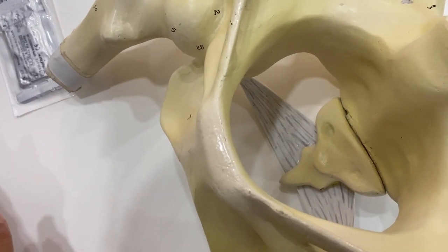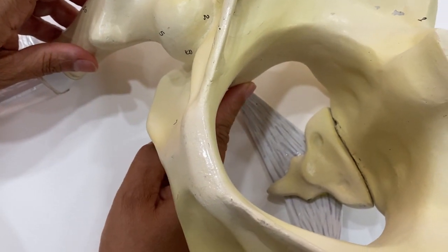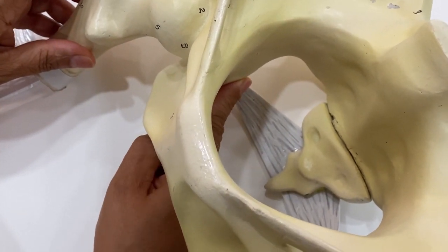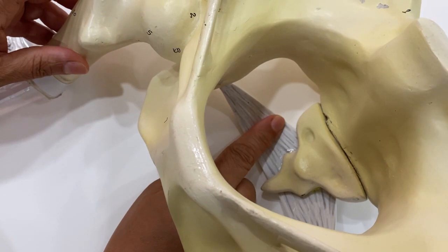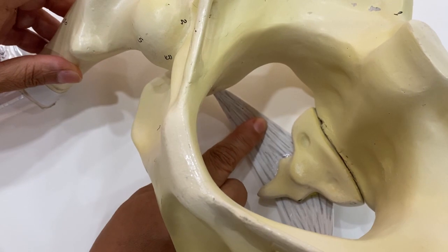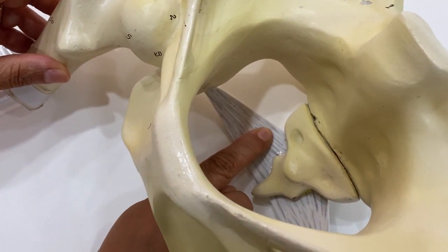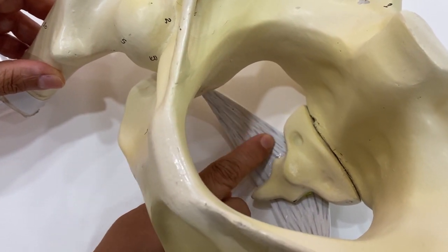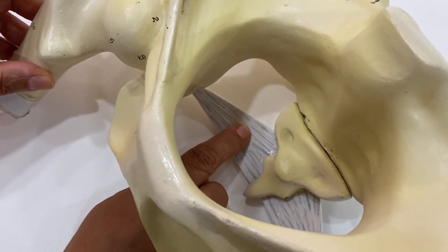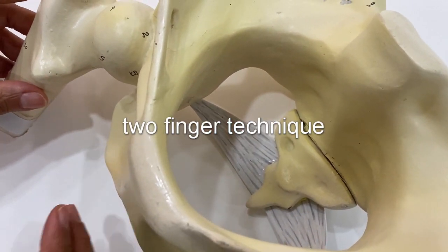The procedure starts by making a longitudinal 3 to 4 cm incision at the apex of the vagina to expose the pararectal space. With your index finger, directly identify the ischial spine and the adjacent sacrospinous ligament. Next, make blunt dissection of the fascia overlying the ligament with your fingertip. Dissection starts laterally at the ischial spine and moves medially. Once you feel the corrugation at the anterior surface of the ligament, the dissection is satisfactory.